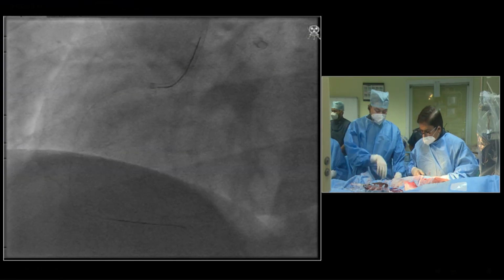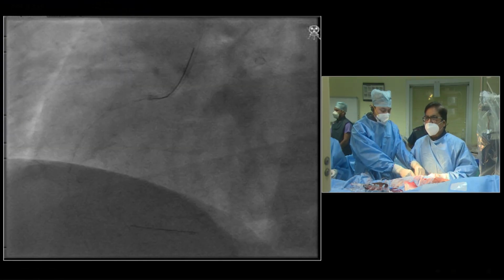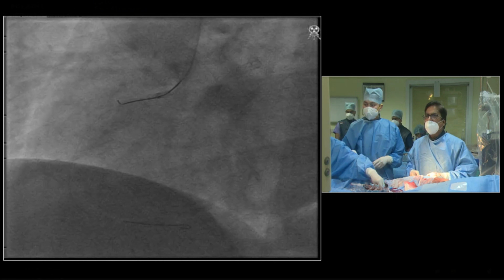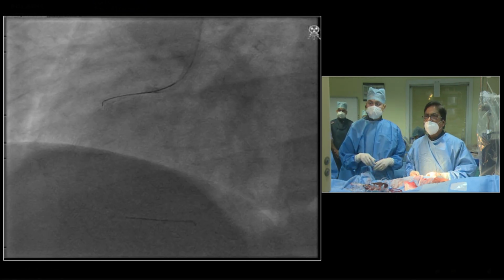No, Bandhu. So that contrast is washed out now. That indicates the heart rate has gone up. I think the heart rate has gone up. Yes, I could not see the heart rate, but definitely the heart rate has gone up.